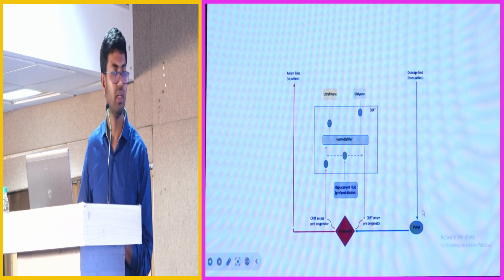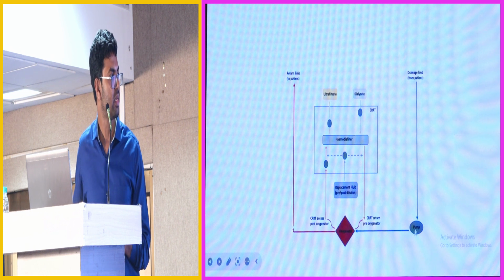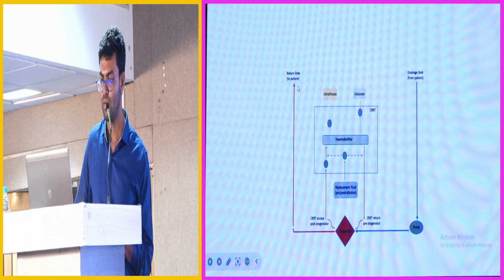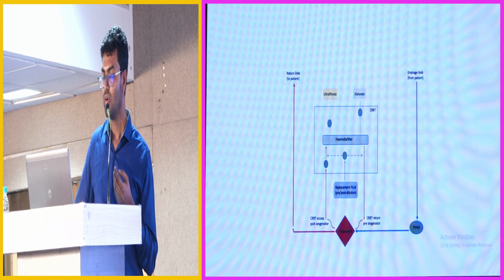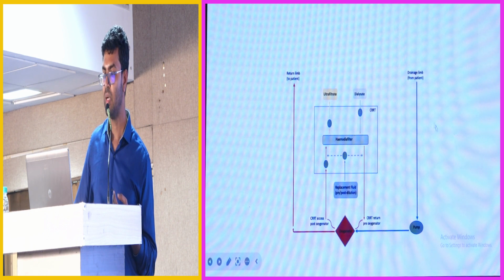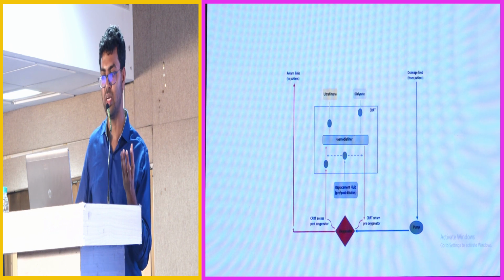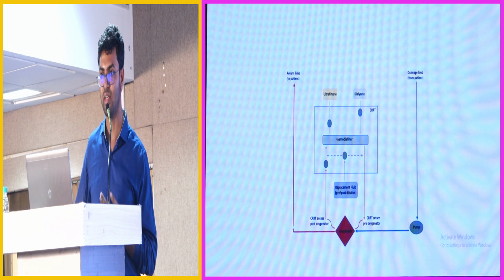So what's happening? I hope you can see the image. This is the pump, this is our drainage cannula, this is our returning cannula, and this is our oxygenator. The pump is actually a centrifugal pump, so there will be a negative pressure built up here. The negative pressure will be around minus 100 millimeters of mercury when it is open. But when you clamp that line, it can go up to minus 300.